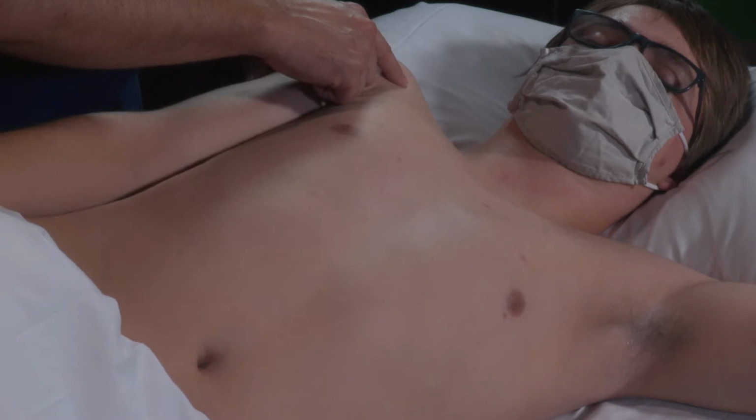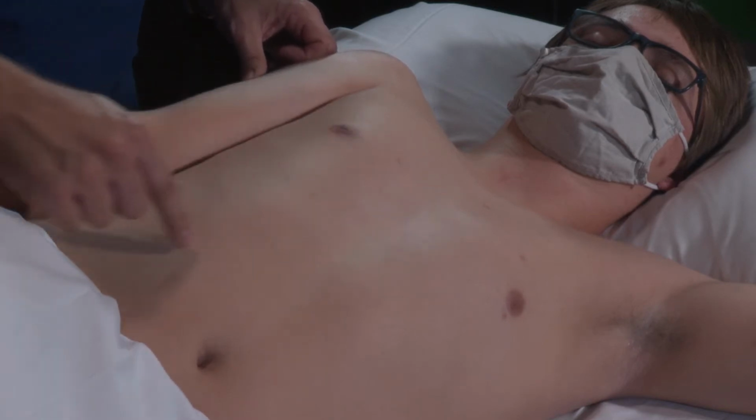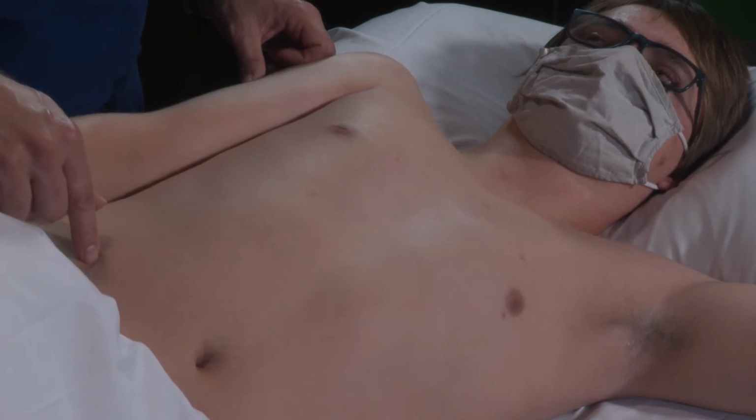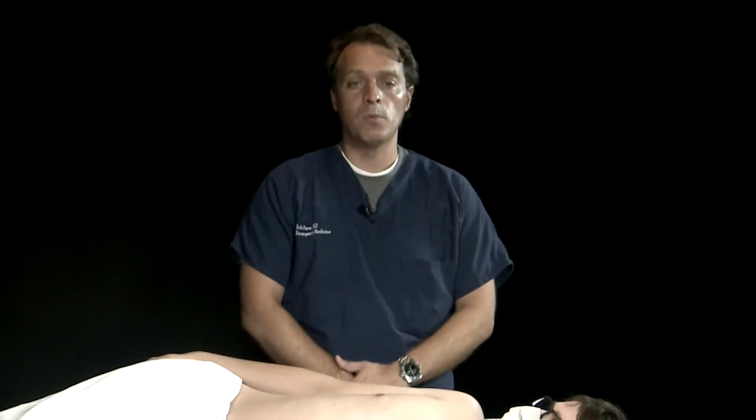After we've obtained our parasternal long axis view, we'll be ready for our parasternal short axis view. To obtain this, we're going to keep the probe in the same location. We're just going to rotate 90 degrees so that we're pointed towards the patient's right hip. That will be our parasternal short axis view orientation. Next, we'll be ready for our apical windows.